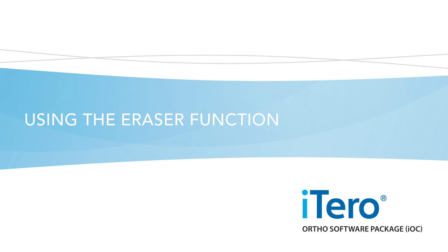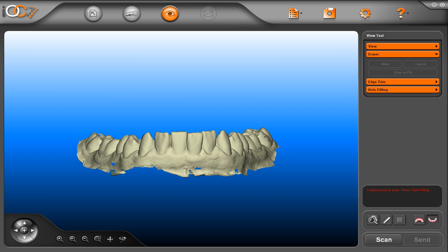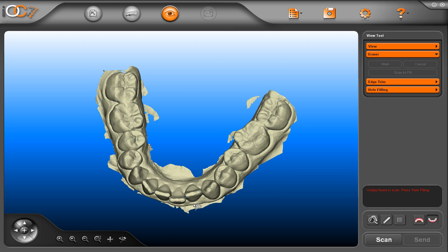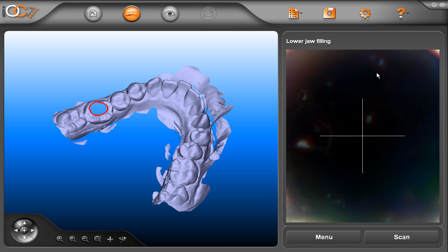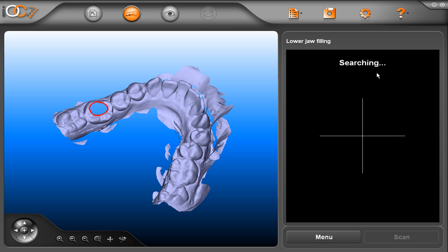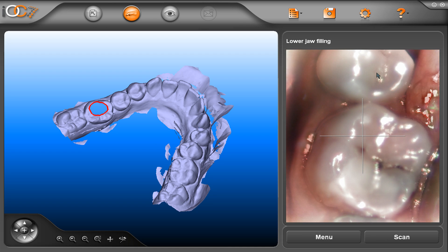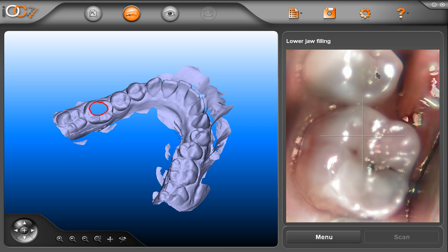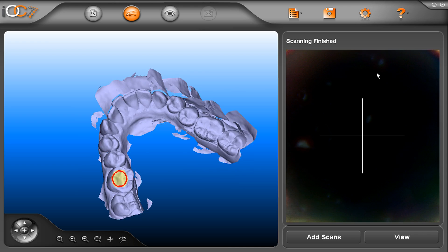Using the eraser function. One useful feature is the eraser tool. To use the eraser, click on eraser. If you have an area where you have some moisture or other artifacts that you wish to remove, simply draw over the area, press mark, and press scan to fill to correct the error. Then position the scanner over the area you wish to fill and press the scan button. The additional scan will automatically fill in the area where you erased the model.